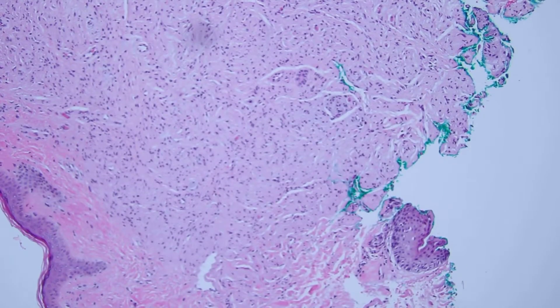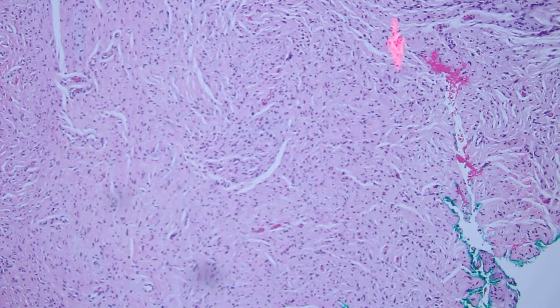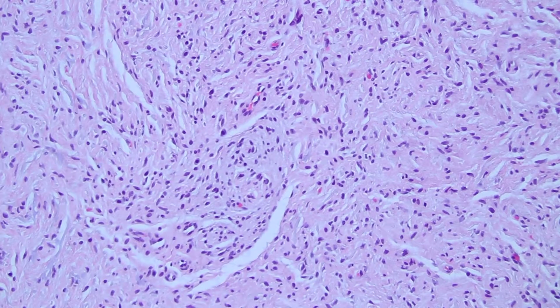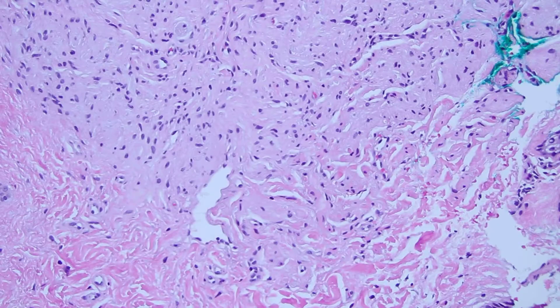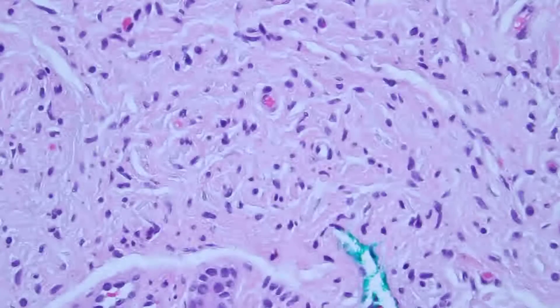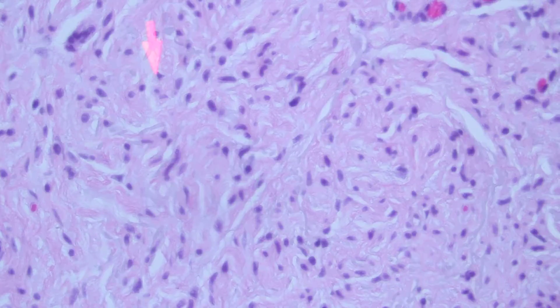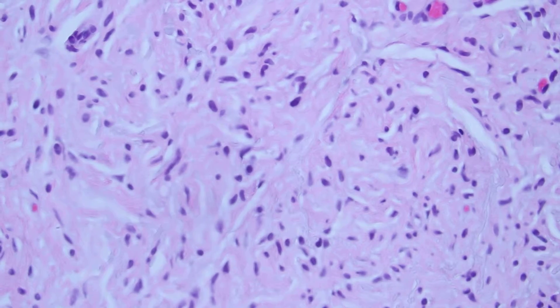As we look down on higher power, we can see that there are cleft-like spaces, there are spindle cells in no specific pattern interspersed among some collagen fibers, but mostly the collagen is being pushed to the side or somewhat entrapped at the edges. There's no fat entrapment here. The cells themselves are spindle-celled, with somewhat wavy or comma-shaped or angulated cells.